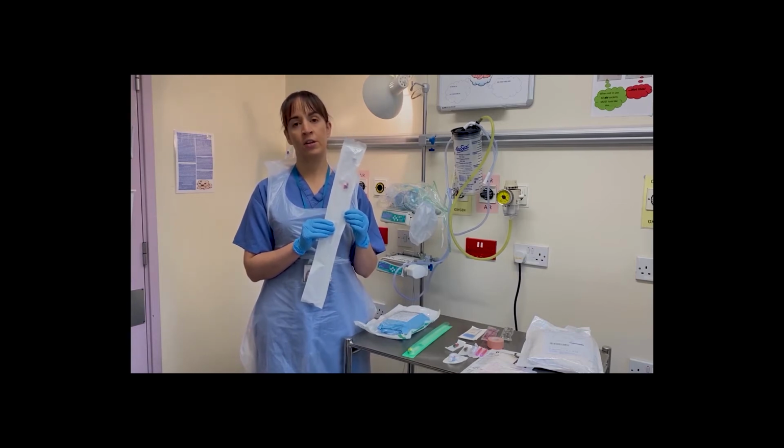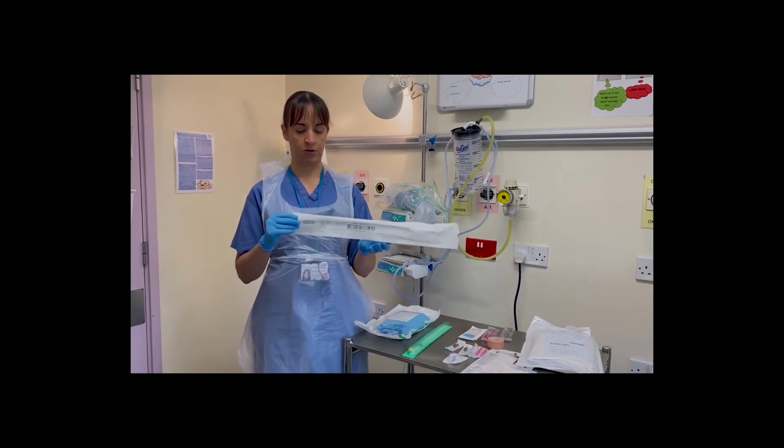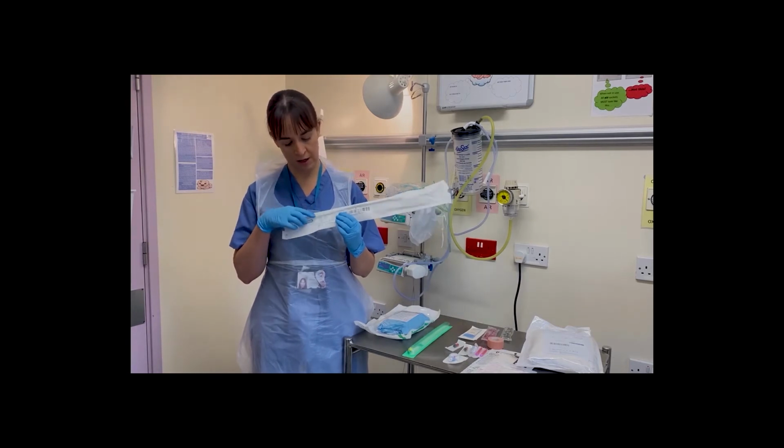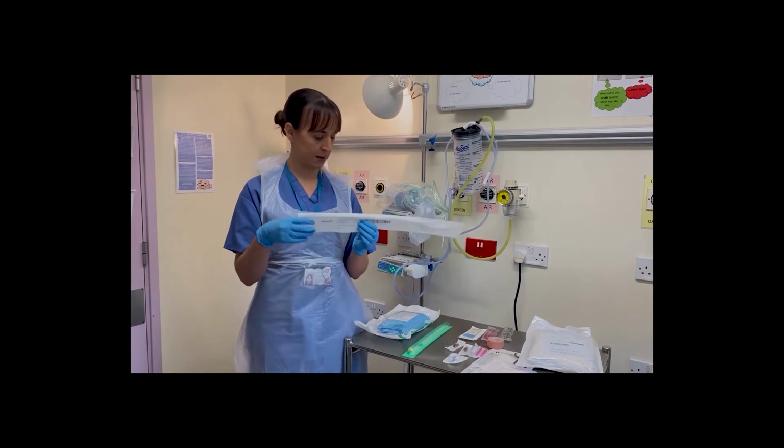So you want to use a 3.5 French for a very small preterm baby. And it also comes in larger sizes such as a 4 French and a 5 French for a bigger baby. And the way you know which one you've got is it says at the back. So this one is a 3.5 French for a small preterm baby.